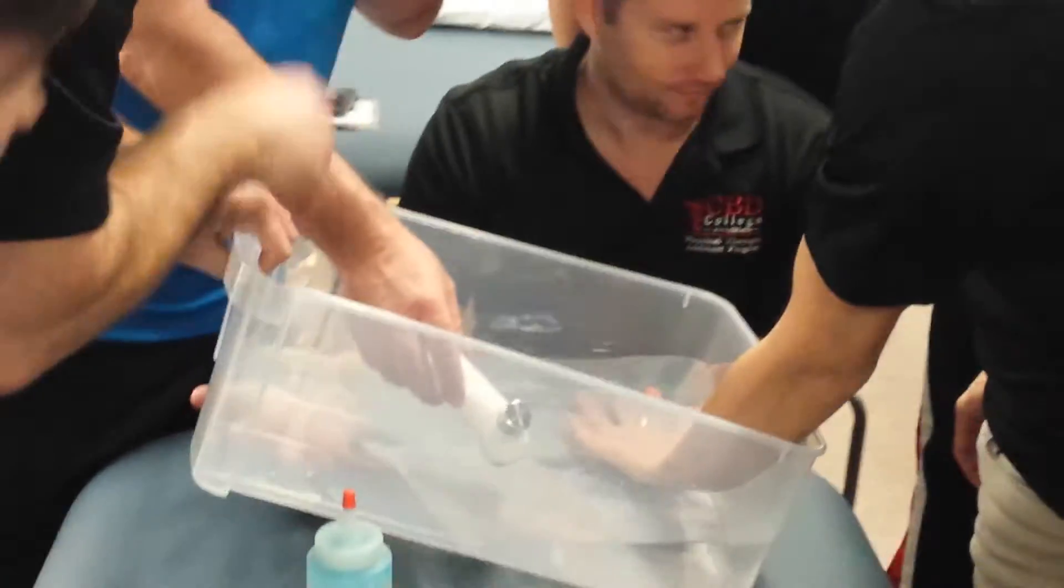So what you want to do is point with your other hand. Point to where the pain is. Right here?